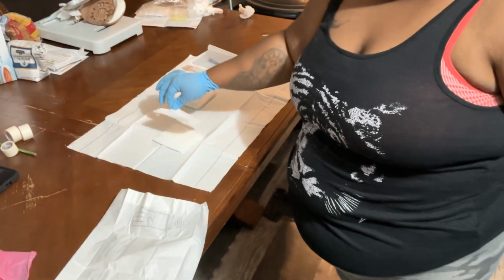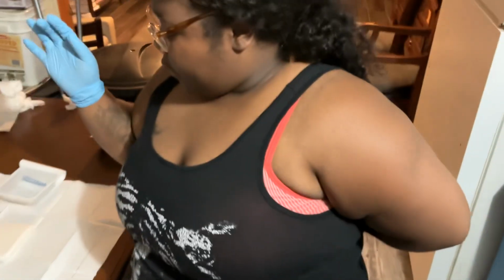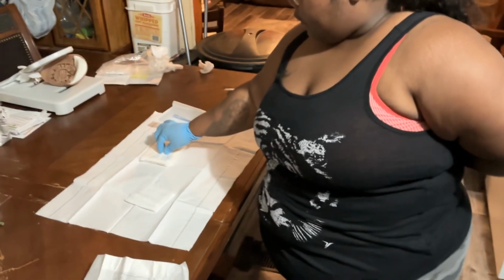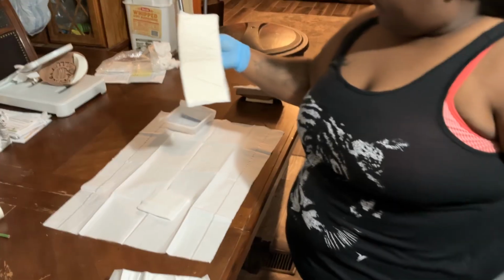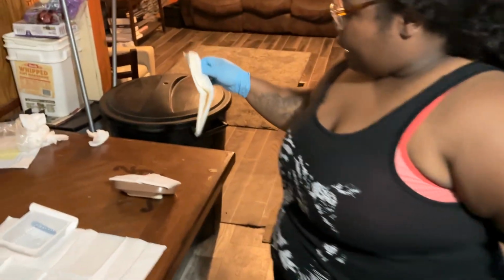Get another one. It's clean. Notice I never touch the part of the gauze that's gonna touch my patient's skin. Drop it. Okay. Gonna grab my ABD pad. Never touch the part that's gonna touch my patient's skin. Okay. I'll put it on like so. Okay.